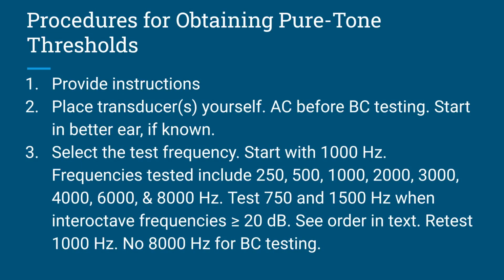You want to provide the instructions to the patient, such as: we are interested in finding the faintest sound you can hear at different pitches. Listen carefully and be sure to press the button as soon as you think you hear a sound and release the button as soon as it goes away. We will be testing each ear separately. Do you have any questions? That's one example of instructions you can give. You want to test 125 hertz, mainly to better characterize low frequency hearing loss.